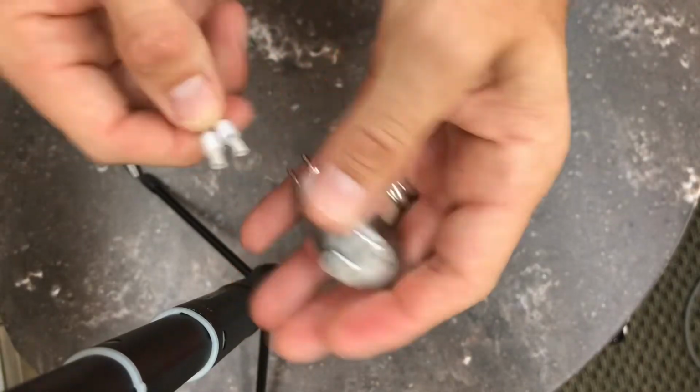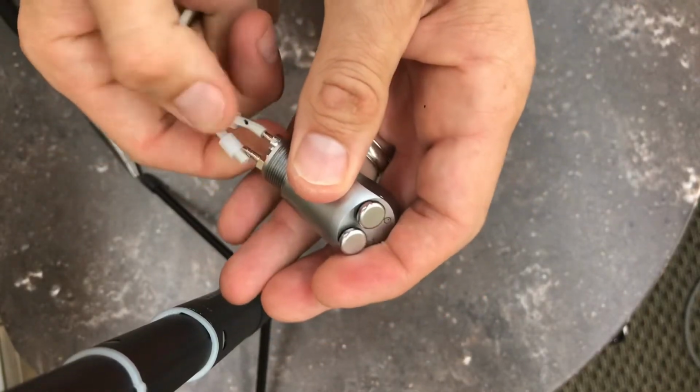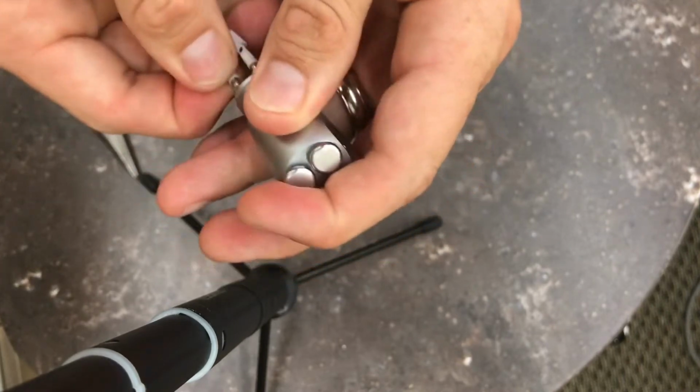Apply the tubing to the male prongs on the new syringe. Since you marked the water, it's pretty easy to know where the water tubing goes.